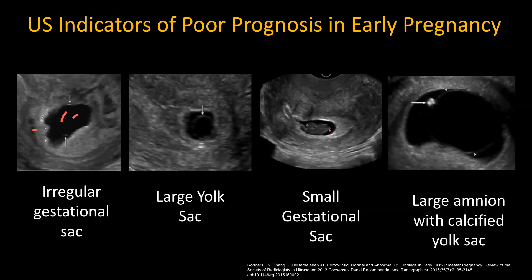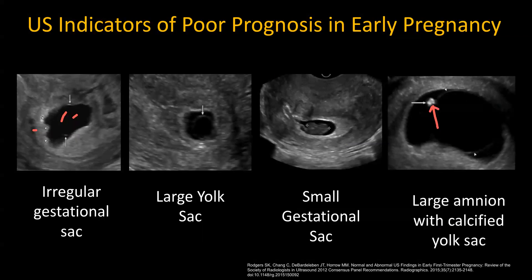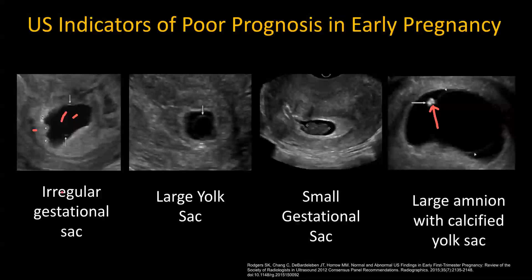Another sign is a small gestational sac — the fetus looks cramped in the space. Another sign is a large amnion with a calcified yolk sac: a fairly large amnion with no visible fetal pole. Other findings include bradycardia — a sustained fetal heart rate below 90 beats per minute — which is a poor prognostic sign.